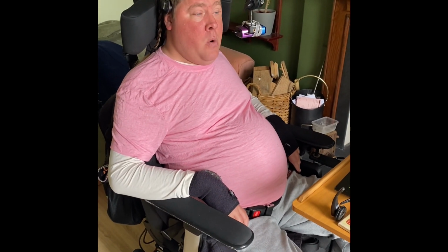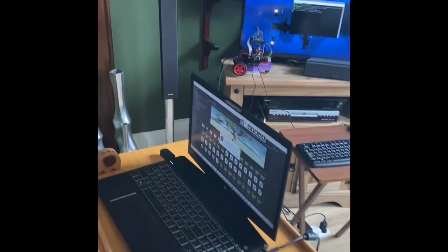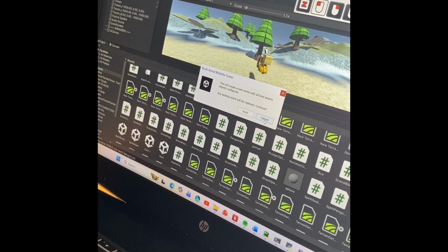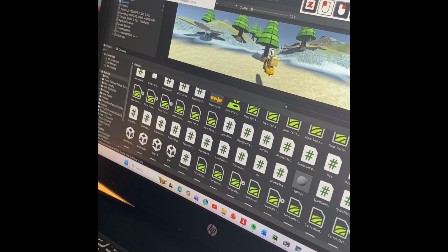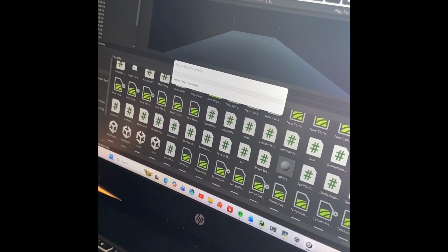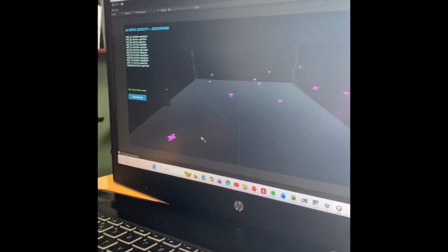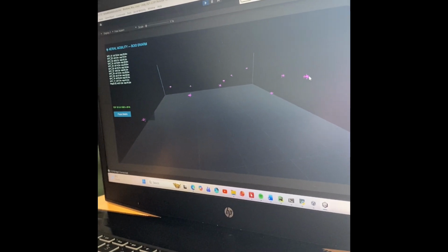The question remains, what would happen if there were multiple vehicles? How would you avoid it? So what I've developed is this Boid system. In order to run this, you click on aerial mobility up here, which is a new tab that has been put in the Unity toolbar. Click on build scene, and then you build it, and then press play. Again, we'll maximize this so you can see what's going on, and this is mapping 12 aerial vehicles and ensuring that none of the 12 vehicles will hit each other. I'm controlling this one here.